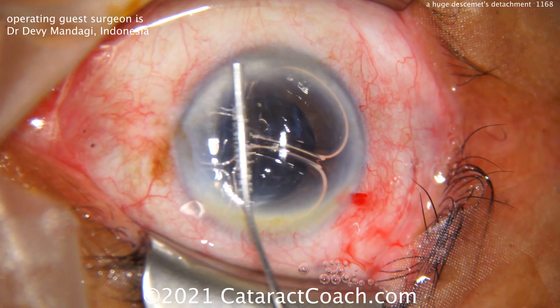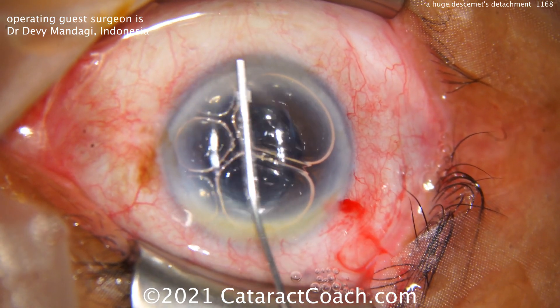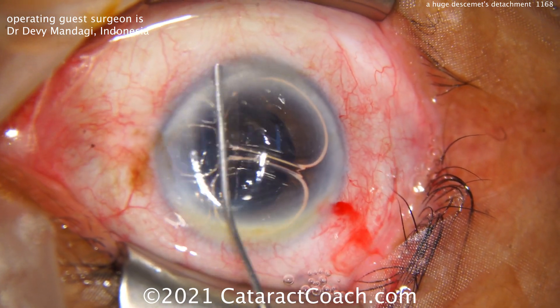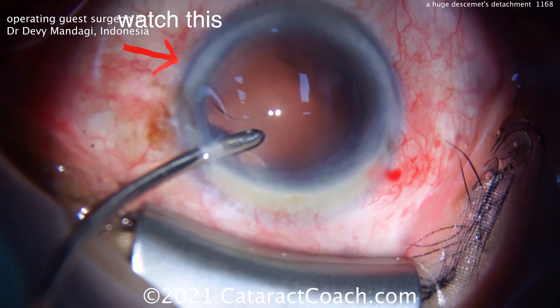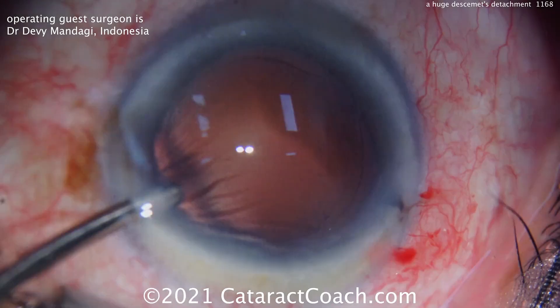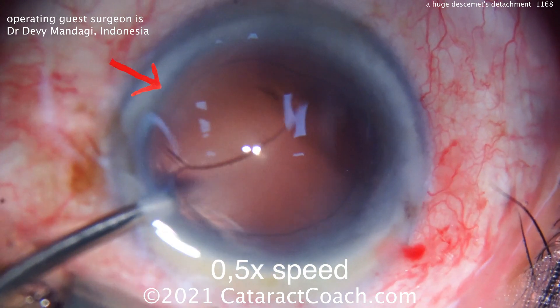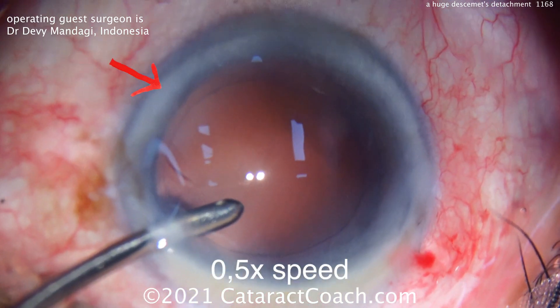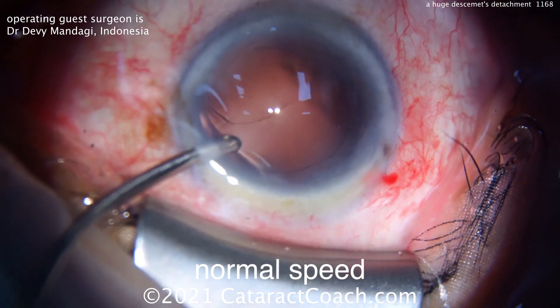Now we can talk about different gases — air versus C3F8 or SF6 — and I can tell you what I prefer. I'll tell you that at the end. But before I do that, let me show you this video one more time. Again, infusion goes in the eye, and the port of the infusion just happens to hit Descemet's right where the incision is, and it gets underneath it and just detaches it. Watch carefully — there it is. So be very careful: don't further detach it, get underneath it, make sure you help support it, bring it back up.